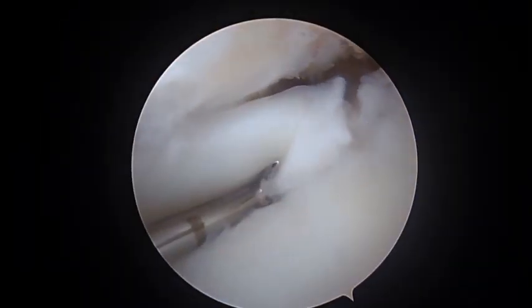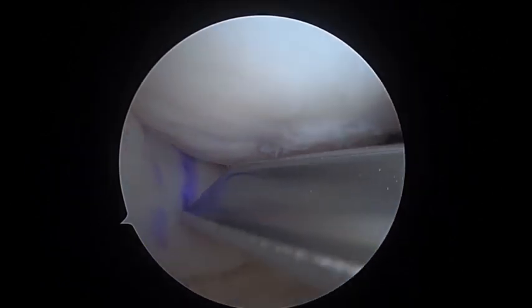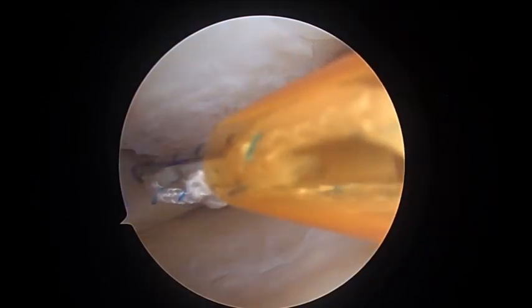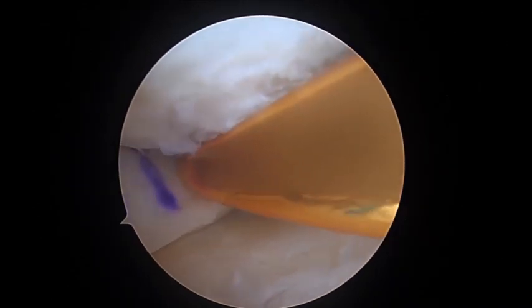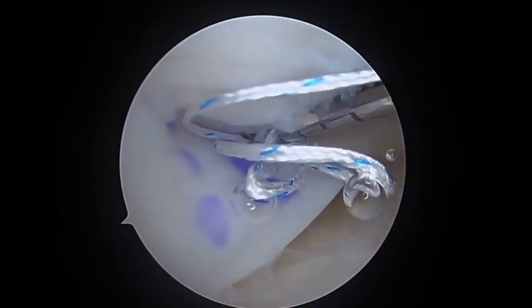We then proceeded with provisional fixation of the meniscus allograft. The graft is secured peripherally using all-inside meniscus fixation devices. We place 5 devices on the upper surface, starting posteriorly and extending along the allograft to the anterior horn and mid-body junction, and 3 devices on the lower surface in a horizontal mattress fashion. We place these in alternating fashion with the upper sutures, which are placed in vertical mattress fashion.